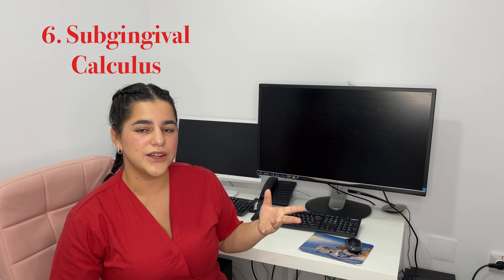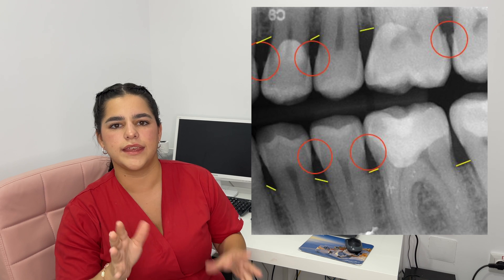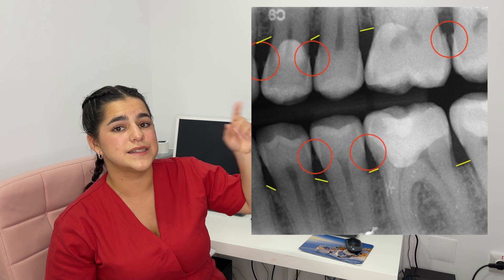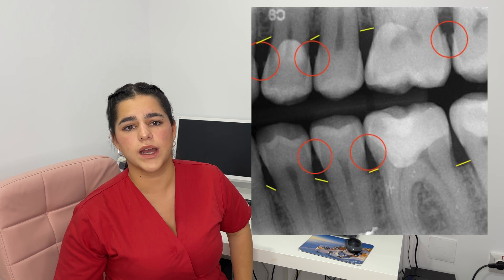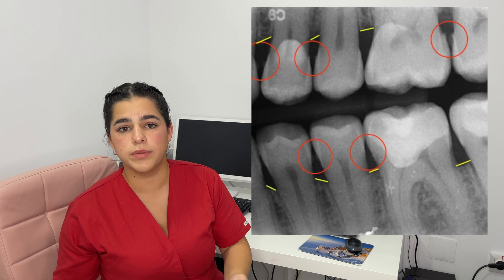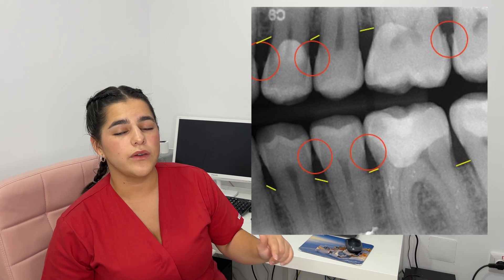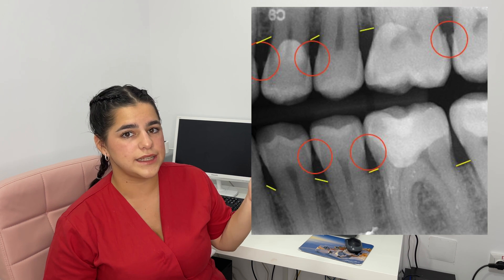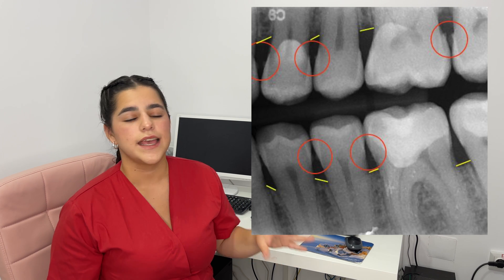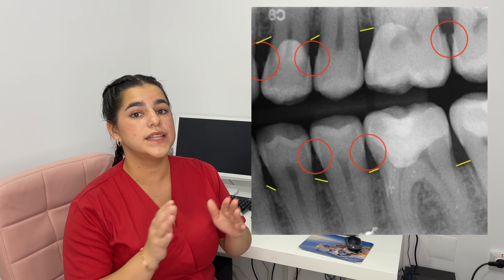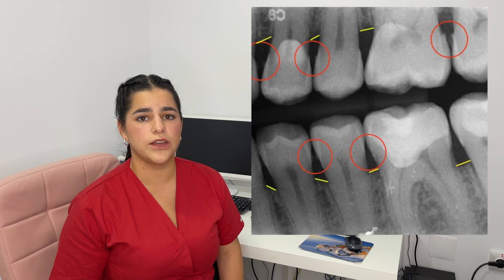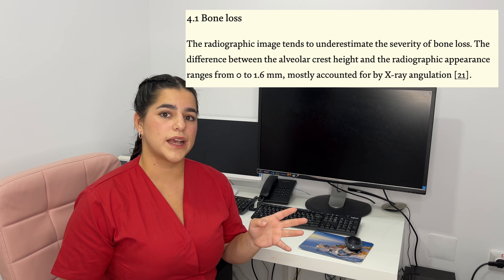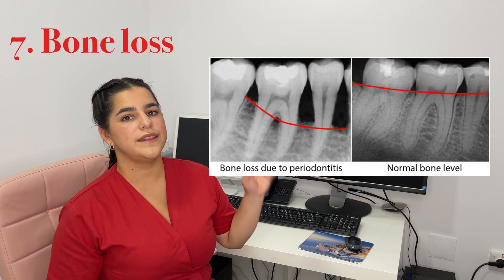Moving to subgingival calculus — it is radio-opaque on x-rays, not as bright as metal, but visible as small white links here and there. In this image, wherever circled in red, you can see subgingival calculus that must be removed, otherwise it will develop into a periodontal problem requiring periodontal treatment. In this image, the yellow lines show that interdental bone papillae are very retracted — we call them blunt — which already indicates periodontal disease. Always refer to a specialist to investigate. Also remember: it always looks better on x-ray than in real life. The radiographic image tends to underestimate bone loss severity by 0 to 1.6 millimeters compared to real life, so always check clinically as well.